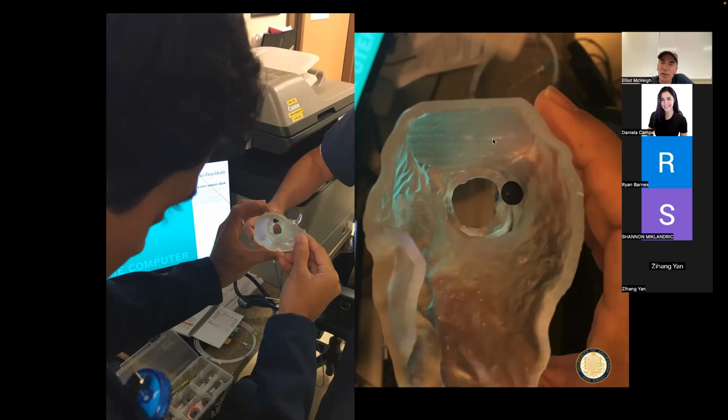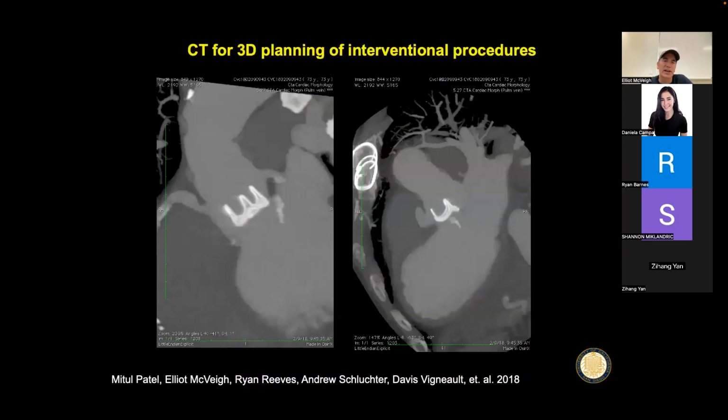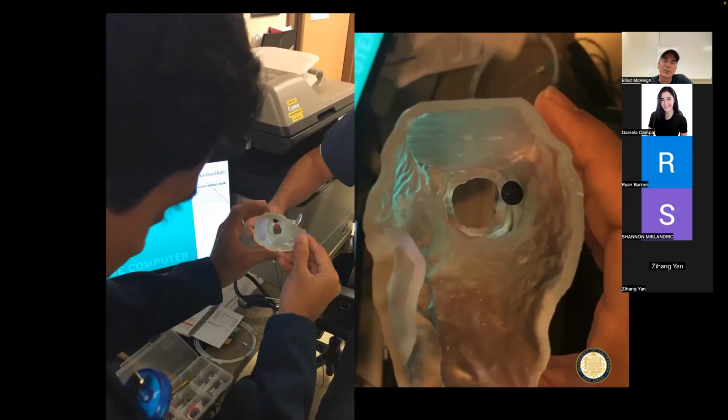The question: could you, instead of cracking this guy's chest, just put some plugs in here? So the question was, what size plugs would fit in that geometry? You couldn't really figure that out from these pictures. So we printed this. This is the Amplatz plug rep, and he's got this huge case full of different sizes of plugs. And here's the interventional cardiologist, one of the guys here at UCSD, going through one by one and saying, okay, what size should I use? Where am I going to put the first one? How many do I need across here?